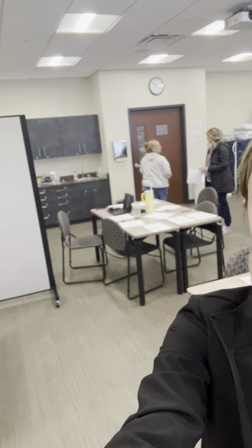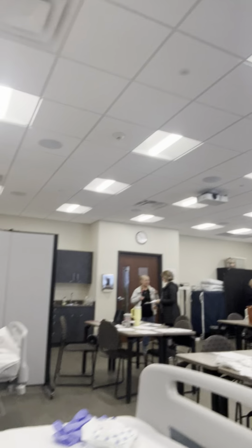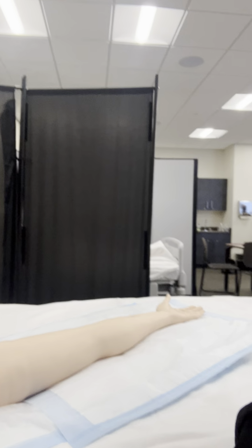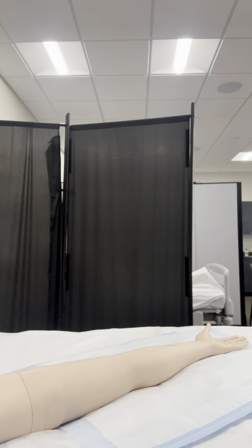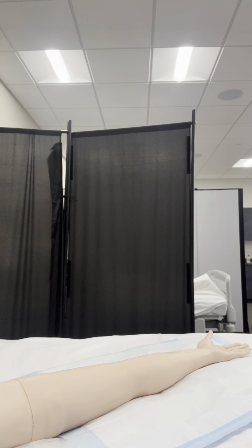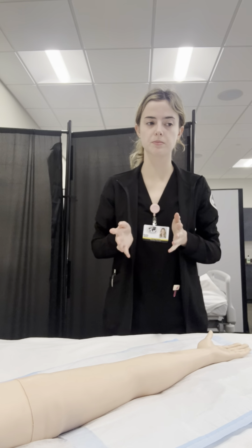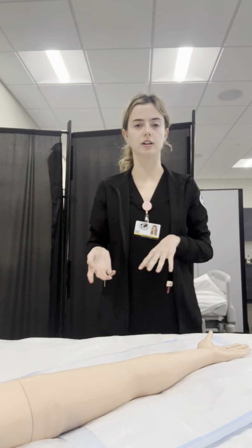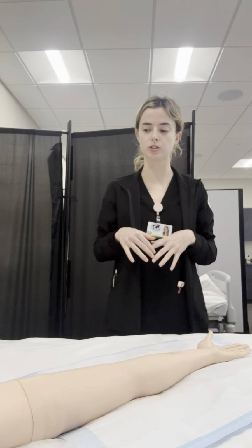Okay, here is my 360 of the room. So my first step would be to verify the provider's orders and starting an IV. So I verify those orders.